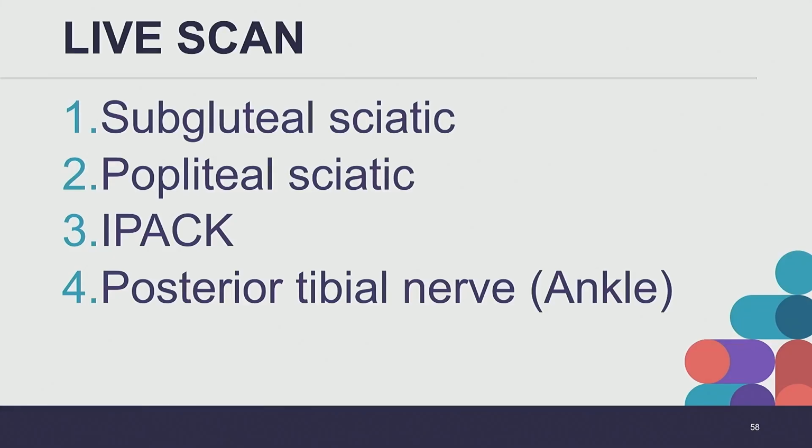Now I'm going to fan up towards the shaft of the femur. It starts to flatten out a bit. You can still see the pulsating popliteal artery. So if you ever see those humps, those condyles, you're a little too distal into that popliteal fossa. So scan a little more cranially until you see that flattening of that femoral shaft.